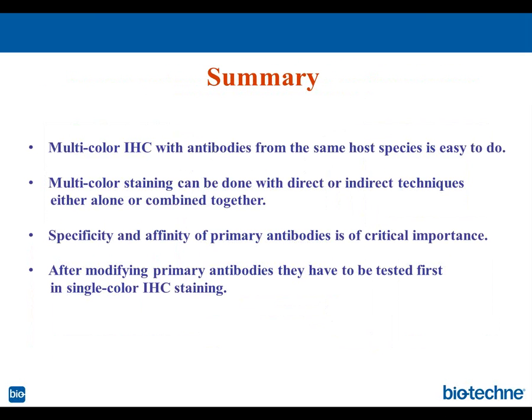Another solution for quenching endogenous autofluorescence: people sometimes use copper sulfate. Also, you can Google it and find out online how to do these different solutions. But yes, this is a big problem, and the only way to deal with it is to use these treatments, or you need to find different labels. Instead of fluorescence, you may want to go to chromogenic. So that's a big issue, and unfortunately, it's not solved yet. How to block autofluorescence in tissues.